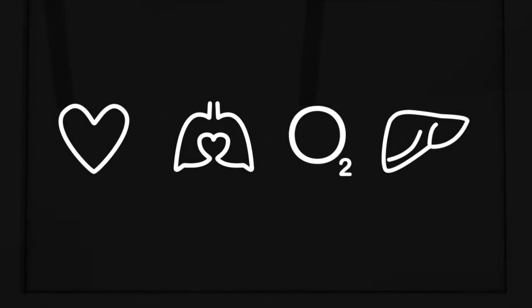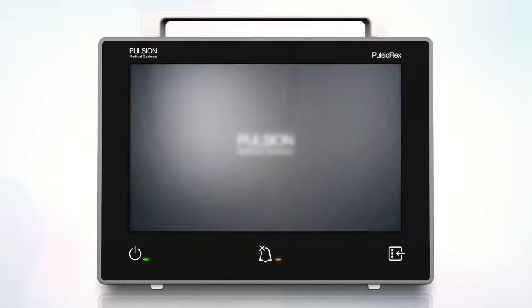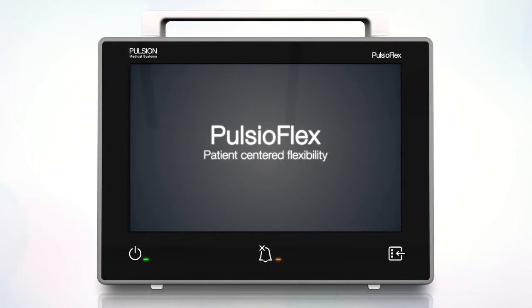The PulsioFlex monitor offers a broad range of hemodynamic parameters that can be freely and easily combined depending on each patient's individual needs.